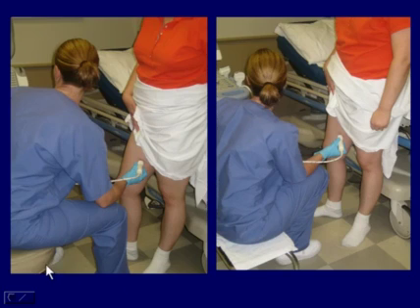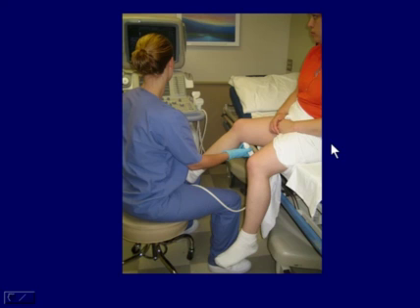We've changed from this stool to a step stool. She's lower down, so she's at a better position here to examine the thigh. We've moved the equipment down in front and lower, so now she's much more ergonomically adjusted so she can complete the exam. When you're through with examining the thigh portion of the leg, when you have to go to the knee and lower, then you can move the bed up, have the patient dangle their leg over the side, go back to a regular task chair or stool, adjust the equipment again so it's at the proper height, and you can complete the evaluation of the calf area.